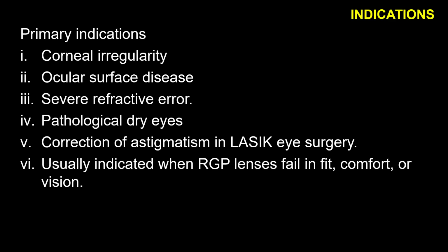Sometimes they will ask you to apply it 8 times up to 10 times or as often as possible. Now, think about your busy schedule in the office, and having to apply the eye drop or the lubricant as often as you want. That can be inconvenient. So scleral contact lens might be ideal to recommend for this patient because that will help lubricate the cornea and can last for a long time.